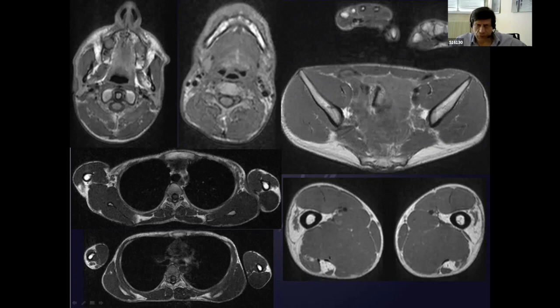In a child, you have to have a brief examination, not a very long examination, because the baby or the child moves, and it's a nightmare. So simple examinations are easier to perform, but in adults, to quantify the muscle fatty replacement, you can also use proton spectroscopy.